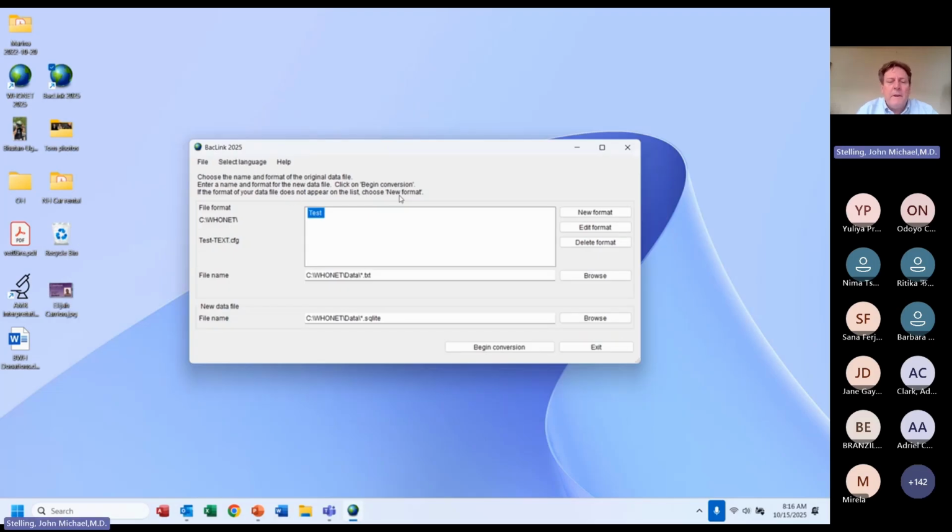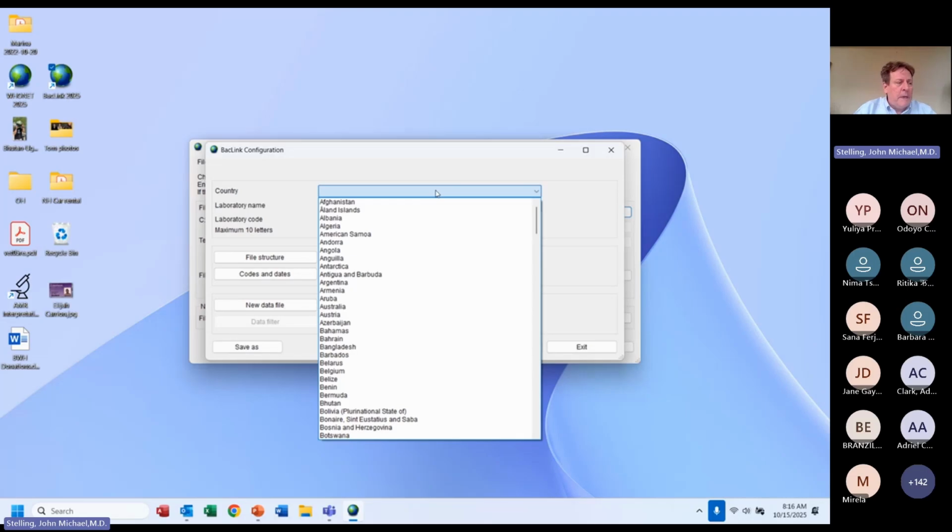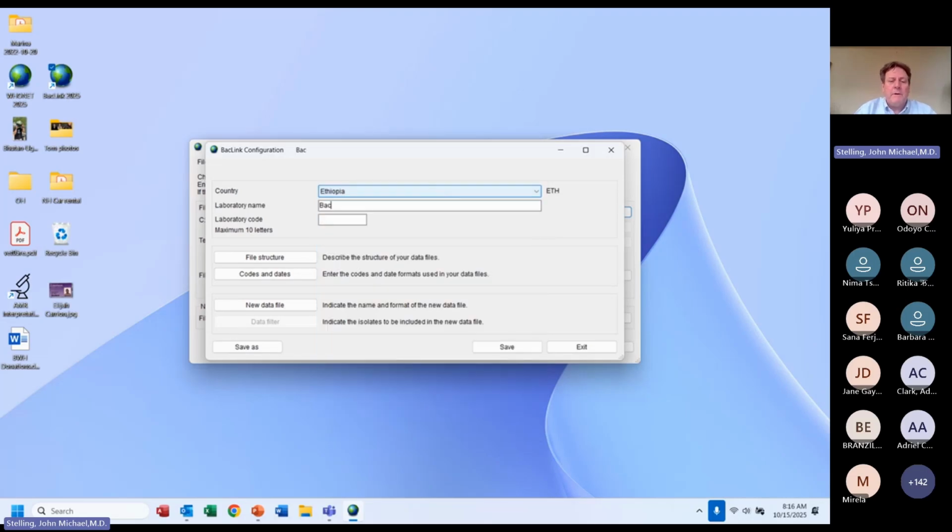Okay, I'm back in English here. Let me delete that, just starting. So basically, I want to teach BacLink a new language. In WHONET, we click on new laboratory. In BacLink, we click on new format. And I say my country. I was in Ethiopia a few days ago, so I'm going to put Ethiopia. And I'm going to call this BacLink demo, BLD, or whatever code you would like to use.